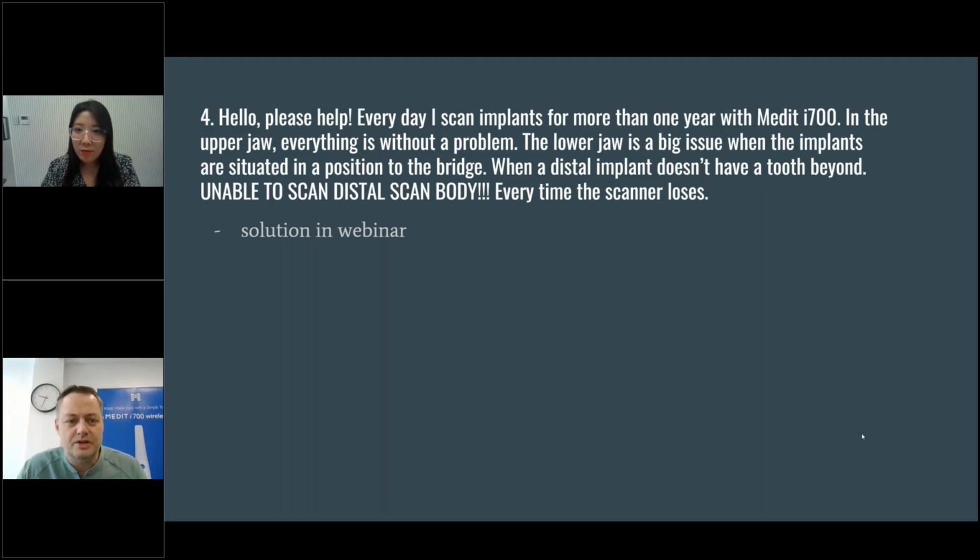Also, my recommendation to you is, if you have the slightest thought that these patterns of resin have moved from one stage to the next, it is better to remove them and redo the scan, because if they are moved, they are going to introduce imprecisions in the ulterior scanning. If not, this is the technique.